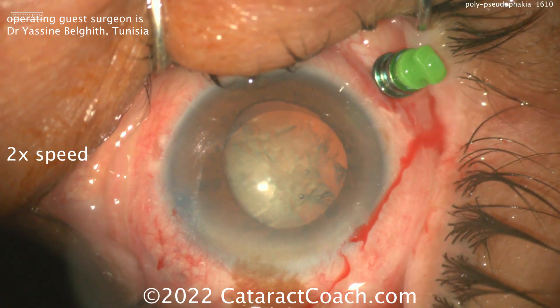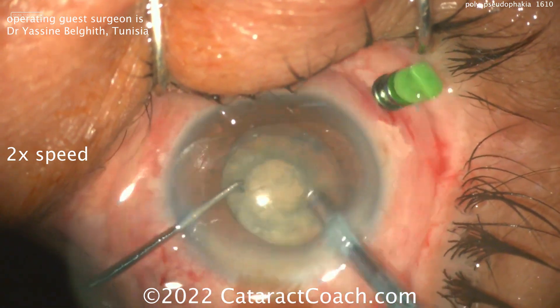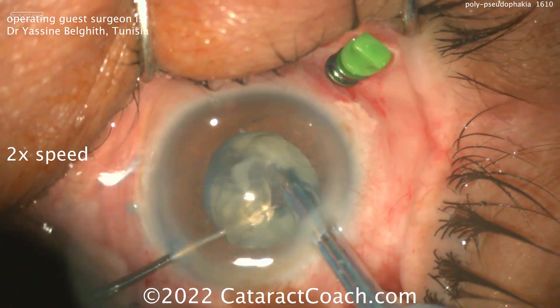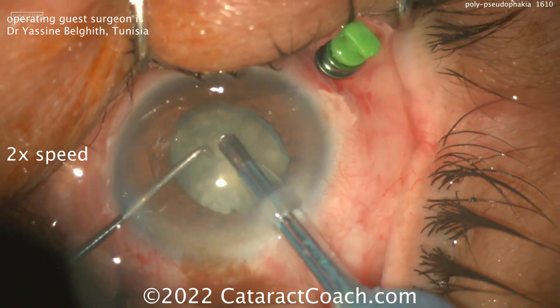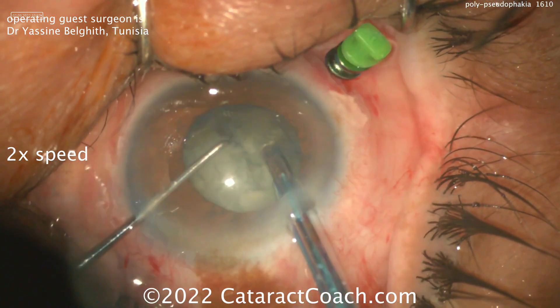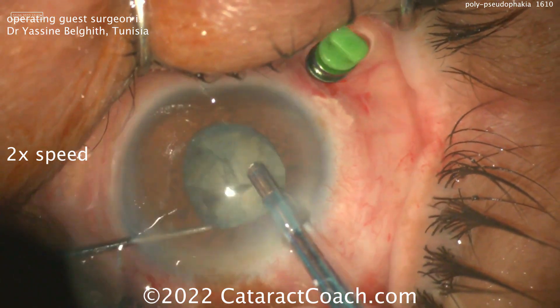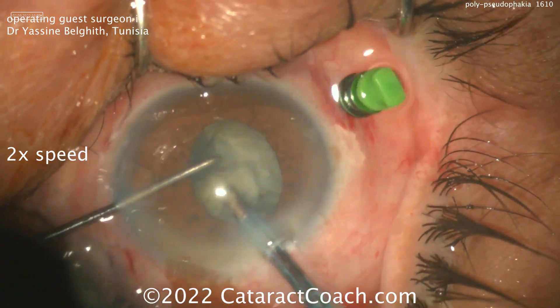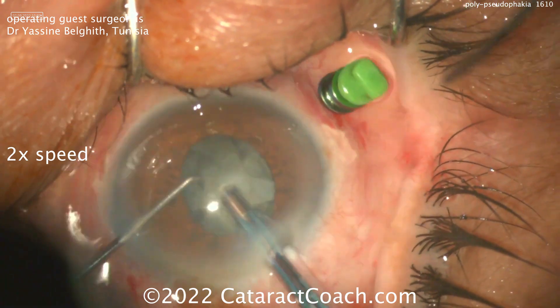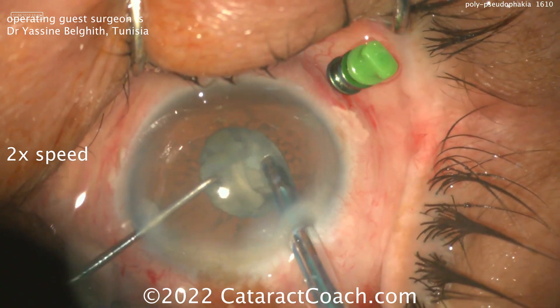When we replace the thick cataract with an IOL that's about one millimeter thin, you can put two IOLs inside the capsular bag, or put one in the bag and one in the sulcus, to achieve the high diopteric power desired. But should you? Lens calculations in these eyes are tough. The quiz question is: in an eye with a short axial length like 16 millimeters, is it easier to calculate if the patient has a shallow AC or a normal or deep AC?